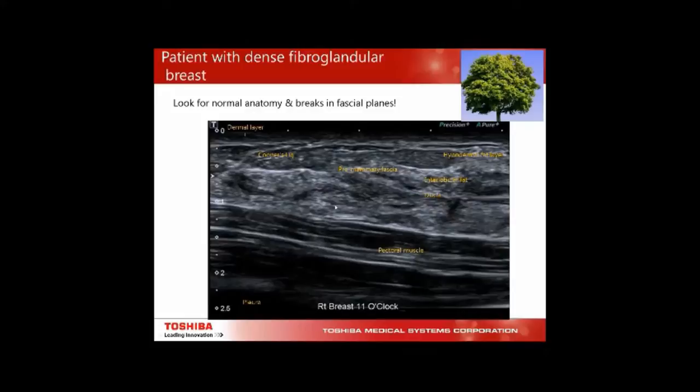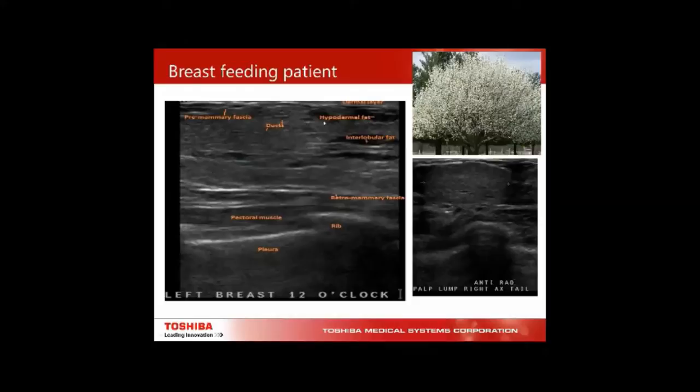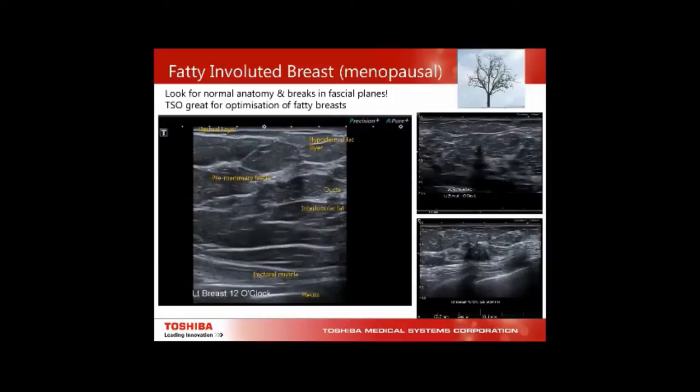Here we have a breastfeeding patient where the premammary fascia is being pushed up and opened out at the Cooper's ligament, with milk-filled ducts pushing through. This patient presented with a lump under the armpit, which we sometimes see when someone is pregnant or lactating — this was accessory breast tissue with ductal tissue within it.